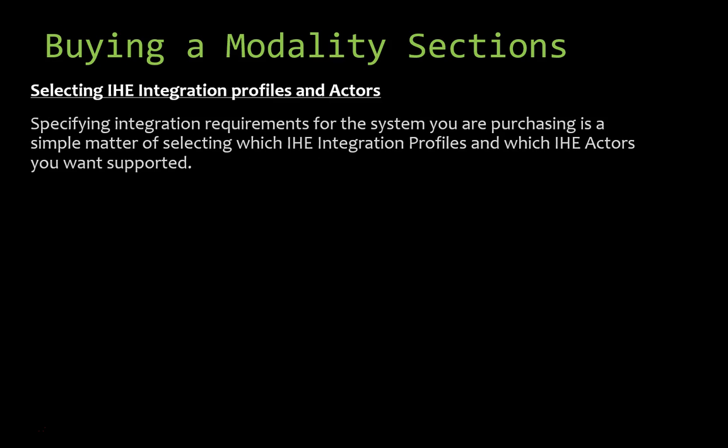Note that some profiles include options that provide additional functionality, which you may also decide to select. For example, there are a lot of functions in the SWF profile. They may provide additional benefits beyond the stated goals. Let me give you a list of the integration profiles relevant to the purchase of a modality and the functionality of each.